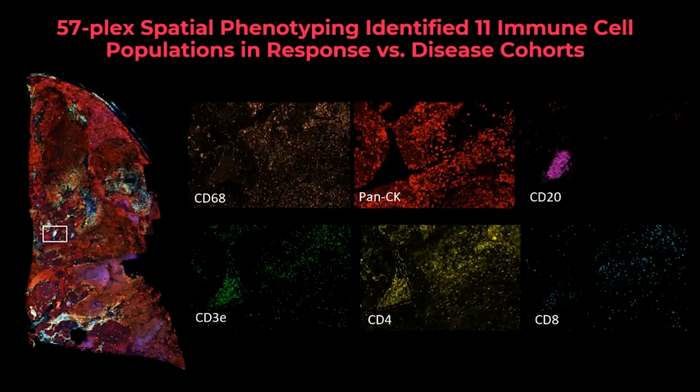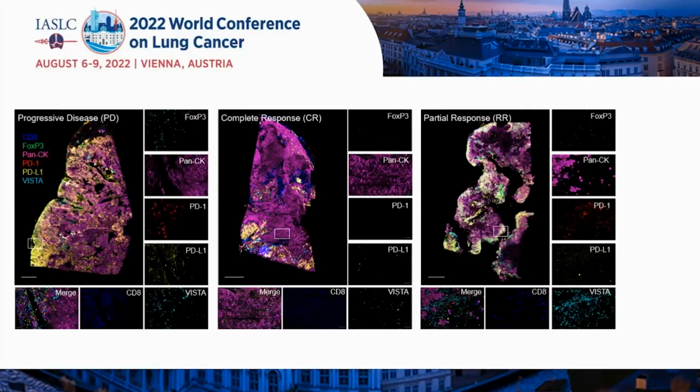And so we've taken these tissues and we've multiplexed whole tissues. This is about 3 million cells at 57 colors with single cell readout. And so you can get an appreciation for tertiary lymphoid structures, lymphoid aggregates, and so on in the CD20 channel here in lung cancer.